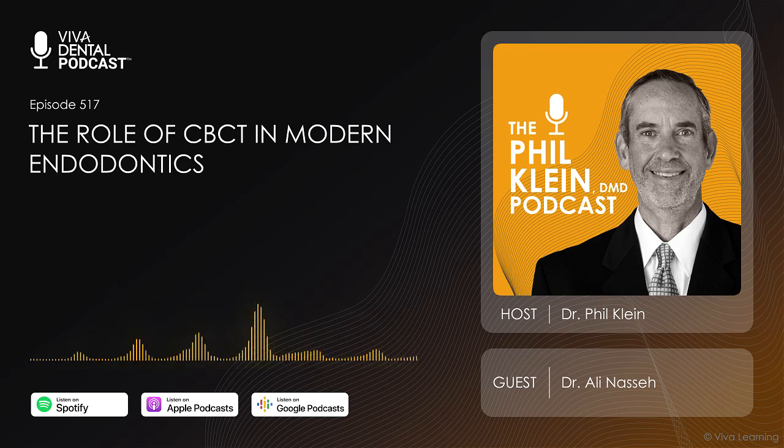The principles of endodontics do not change because of CBCT, but it will help you know where the hidden anatomy is, and it will help you save a lot of time. In my opinion, it will improve your success rate because it helps you treatment plan better: should it be treated, or extracted? Should it be retreated? Should it be surgically treated? There's no question about that, because you have more information and you're wiser for knowing the etiology of the disease in deciding.